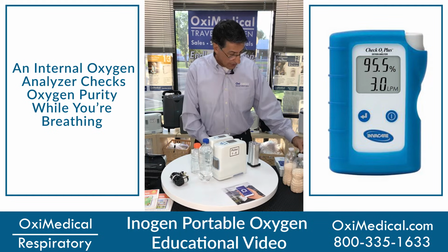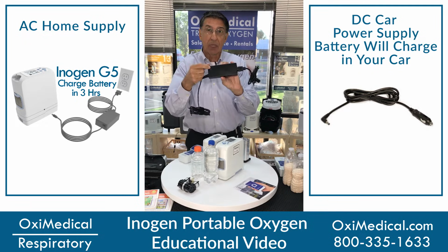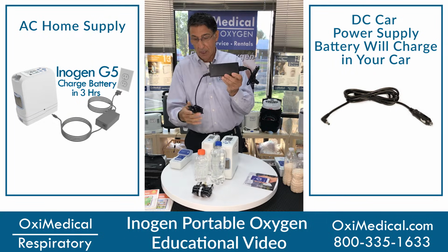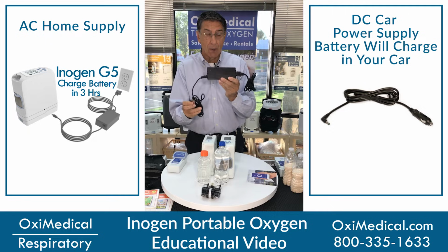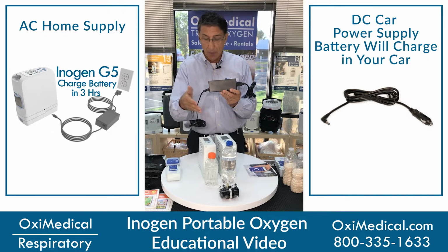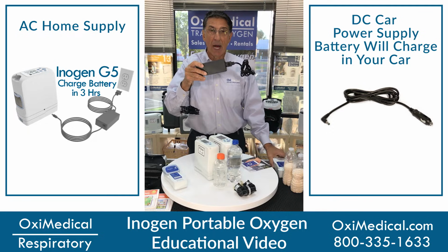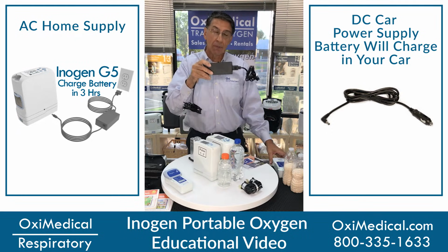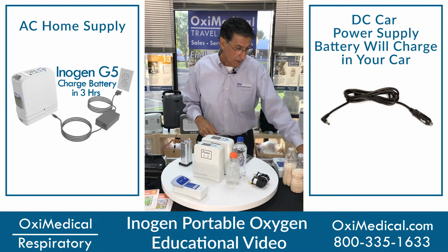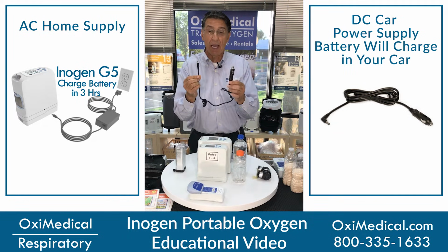They come with an AC power supply, and when you plug it into the wall outlet, you're going to get a green light here to make sure you're getting a good power source. And you have the round peg into the round hole. You can run the Inogen without the battery in it. If you want to reset your battery, just snap out the battery from the base of the machine, plug it into the wall outlet, it will reset itself, pop the battery back in, and you'll be able to use your product after it's reset. You can do the same thing in your car with a DC power supply.